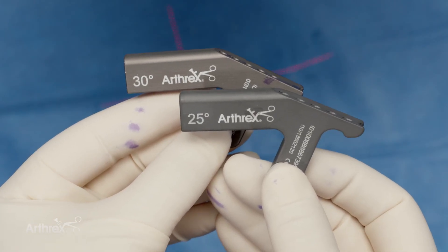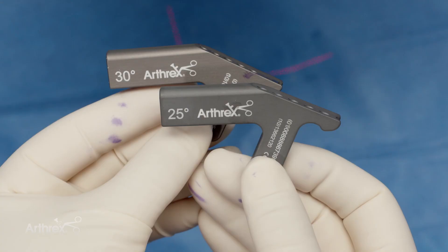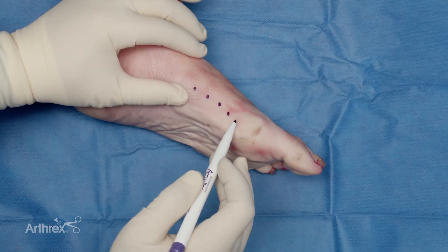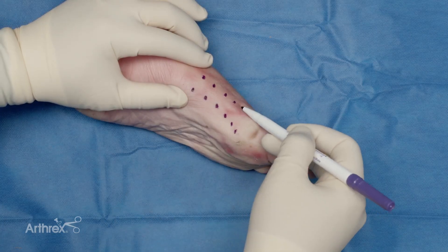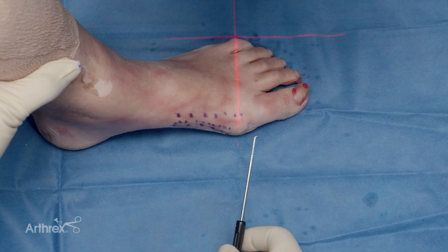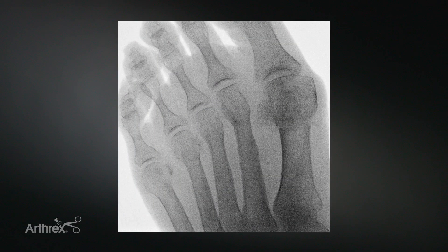The 25-degree angle gives a slightly steeper alignment and placement of the K-wires into the metatarsal. It's important to mark out the midline of your metatarsals, as you'll have a tendency to be a little more plantar than you should be. We've employed a transverse cut through the small percutaneous incision, just proximal to the sesamoids.